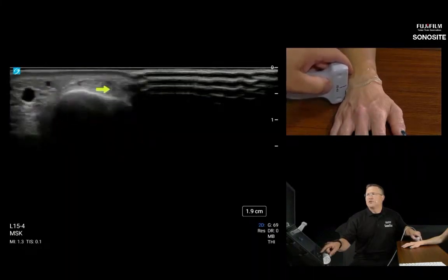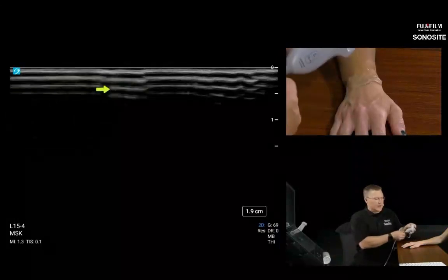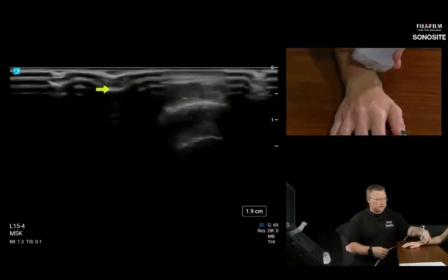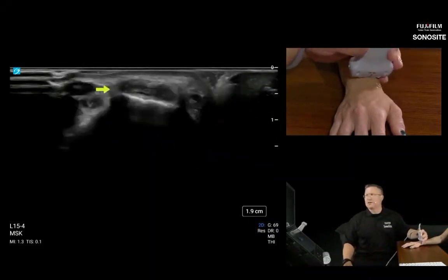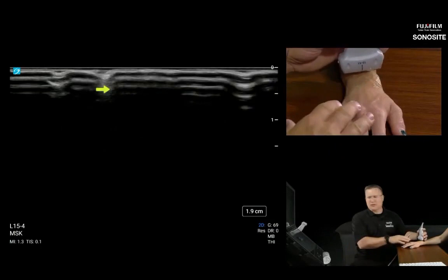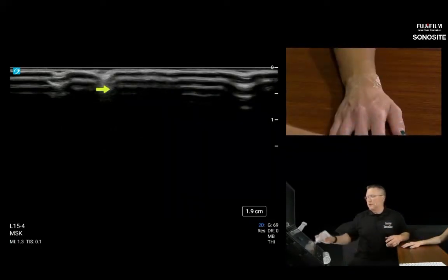So as a general anatomy survey, the larger linear array is okay. It's not great. The L15 does an awesome job for the size of footprint it is to evaluate these structures. But what I'm going to do now is switch over to the L19, and that will be much like switching over to a macro lens on a camera.